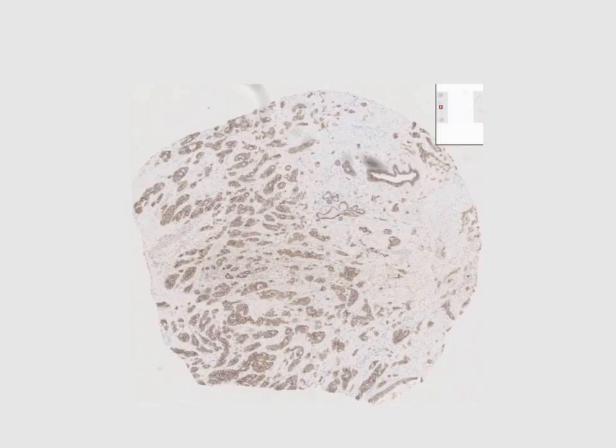The third control is taken from a low-grade invasive ductal carcinoma, and this section shows a clear malignant change in the lining of the cells in comparison to the normal breast tissue. Invasive lobular carcinoma can also be eliminated as there is a high expression of E-cadherin. As the tissue is well differentiated, it is low-grade carcinoma.